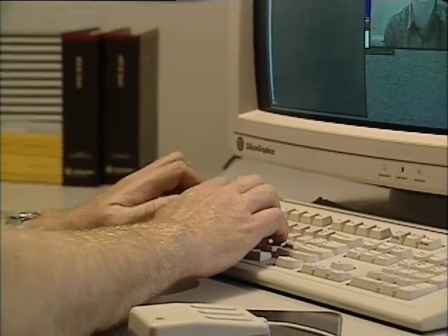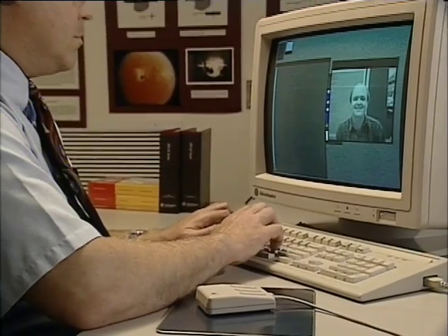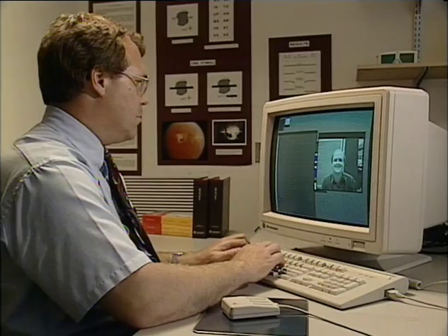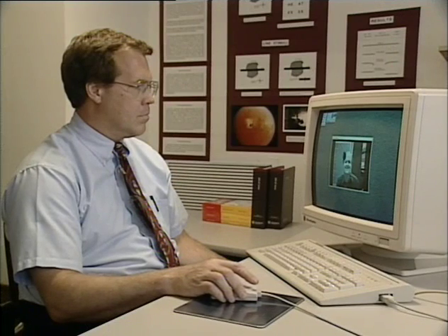While the high-contrast mode should be incorporated into the helmet within a year, Bob's now working on a much more complex form of image processing. There's one form of damaged central vision where the brain responds like this. The sides of the hole get pulled together. The resulting distortion scans across the scene as the person's eyes move. Obviously, the image can become incomprehensible. Bob Massof's response is ingenious.